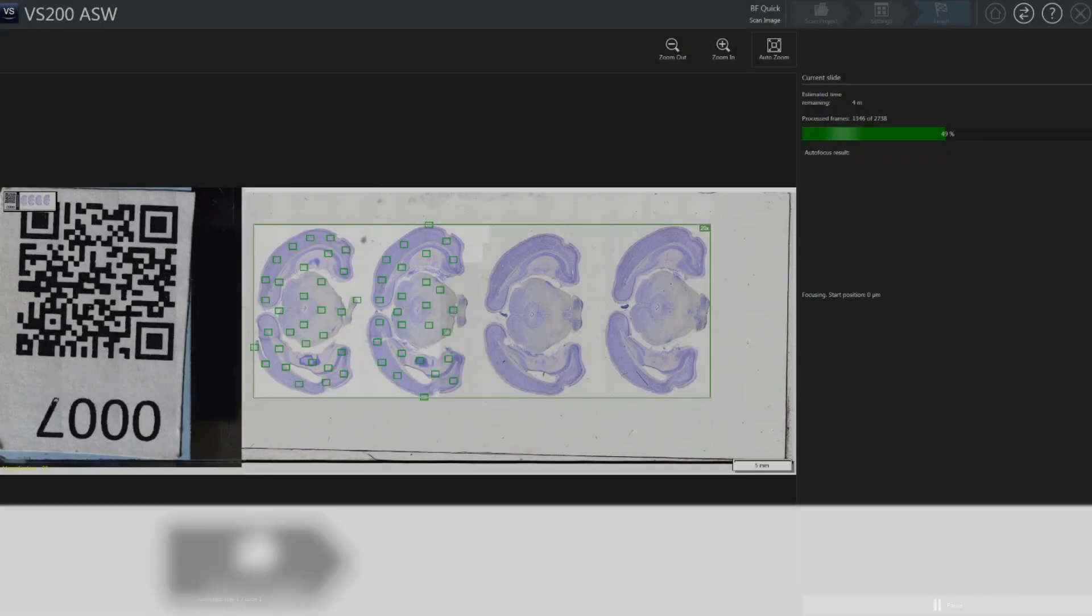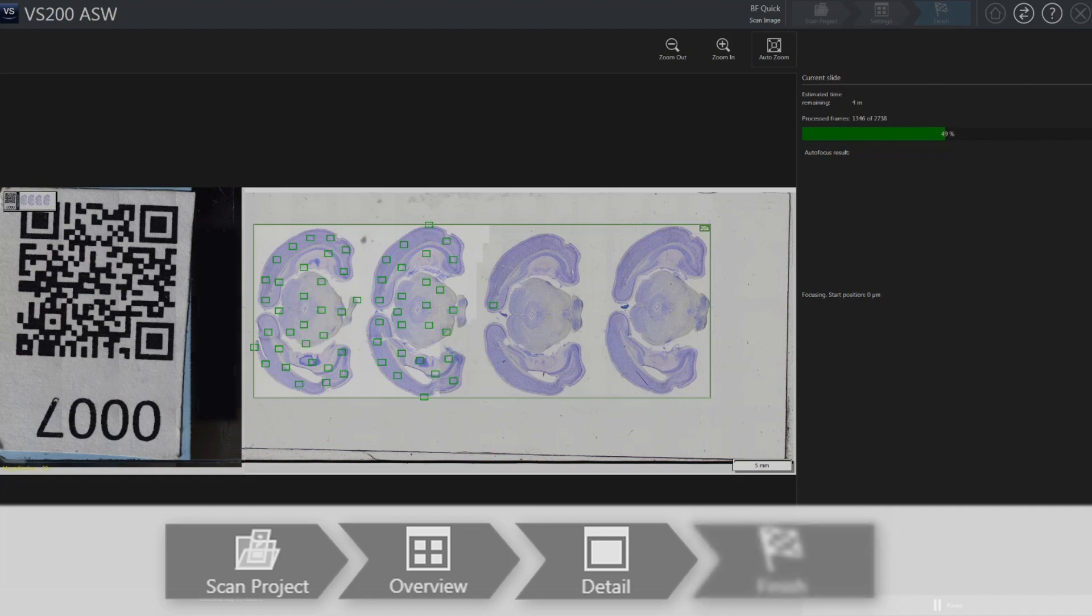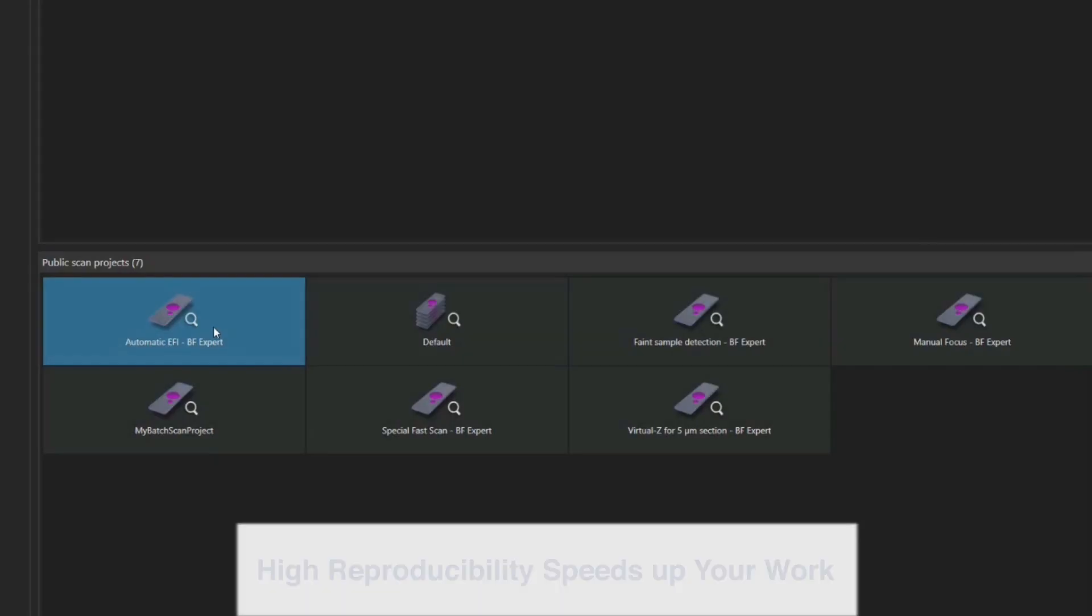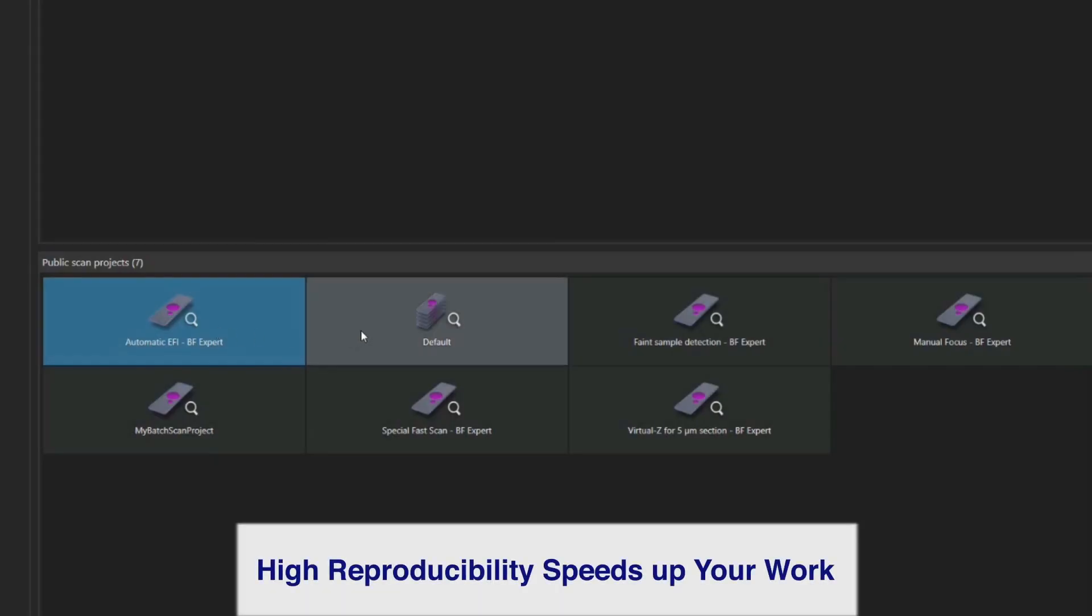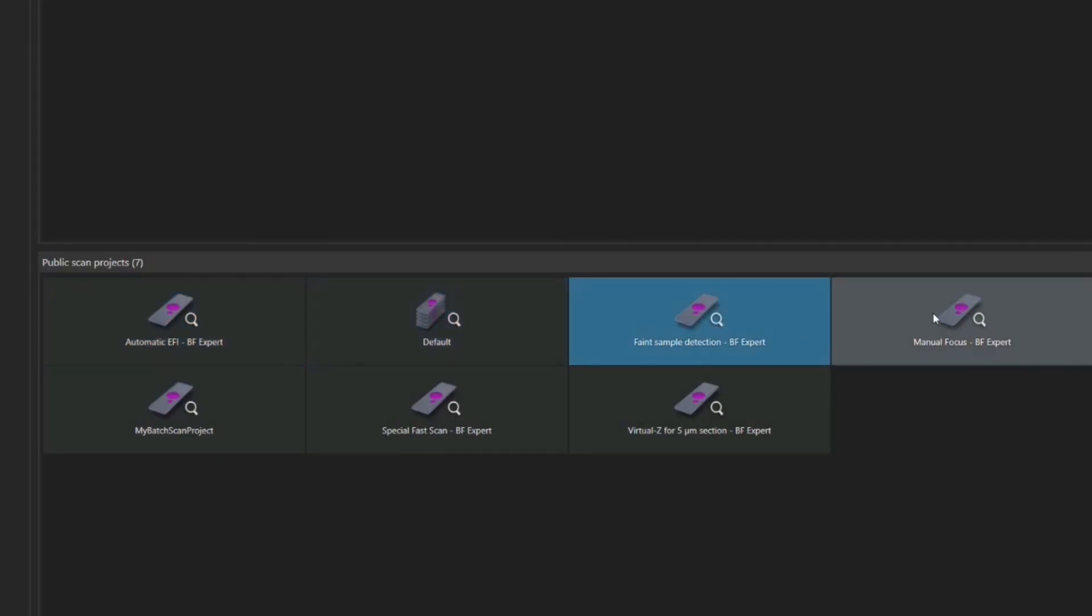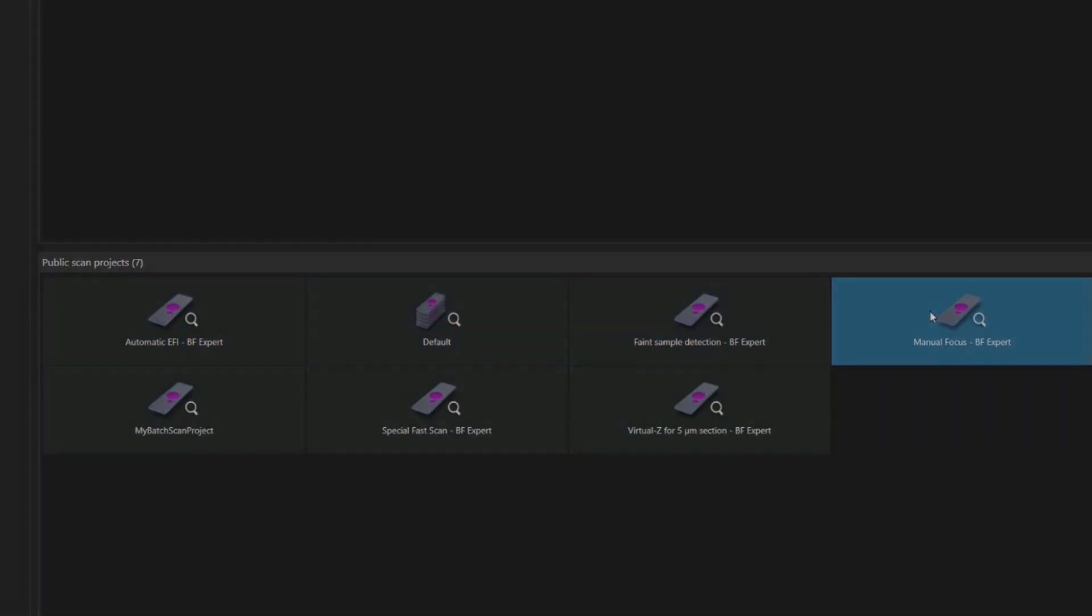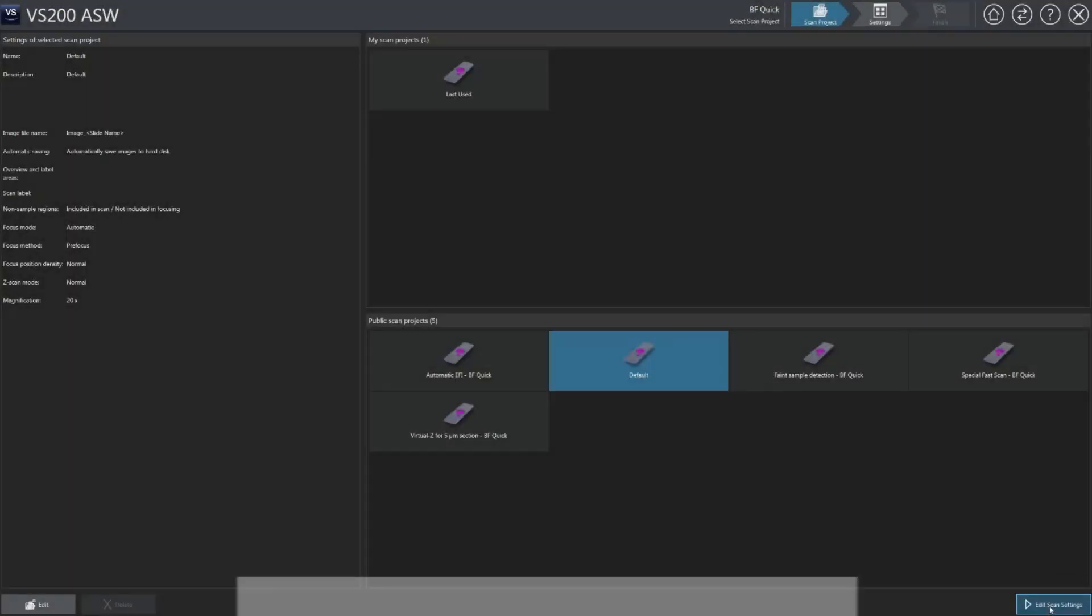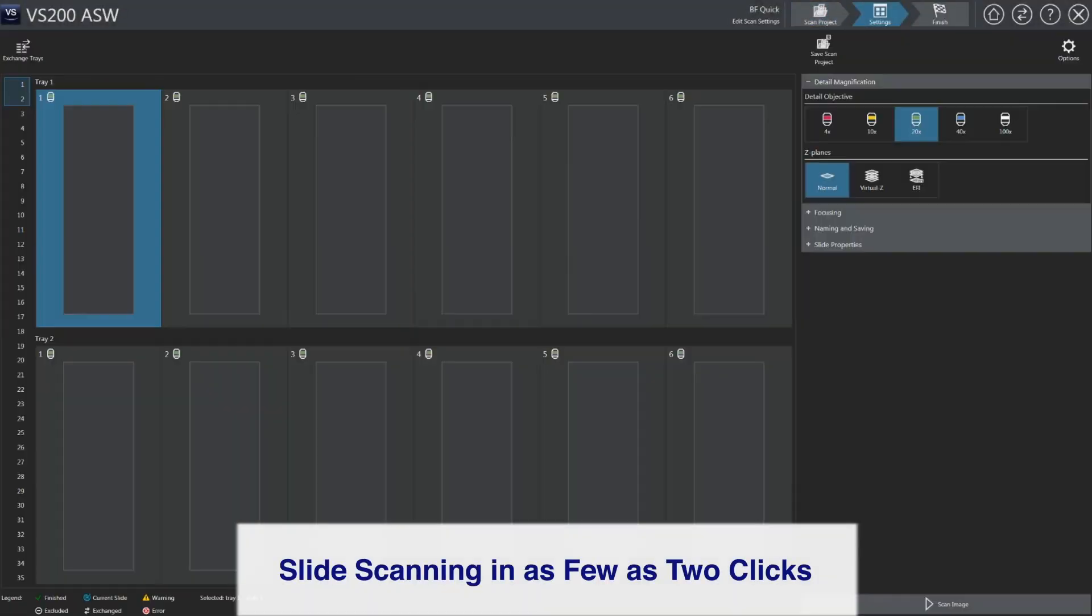The VS200 system offers a simple workflow-oriented interface that makes setting up scans fast and efficient. For repetitive workflows, save and recall your predefined acquisition setting projects. And with quick mode, you can start scanning in as few as two clicks.